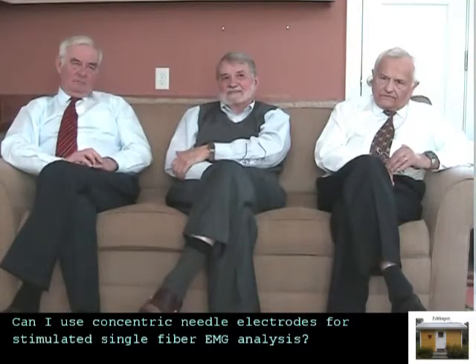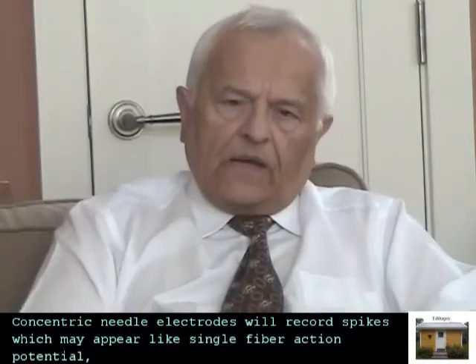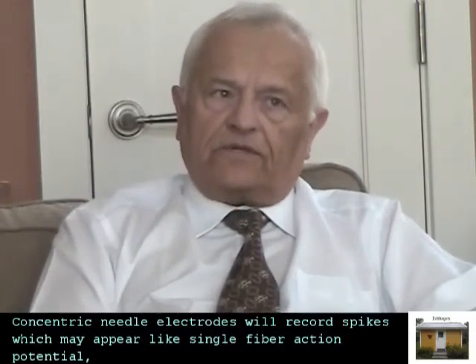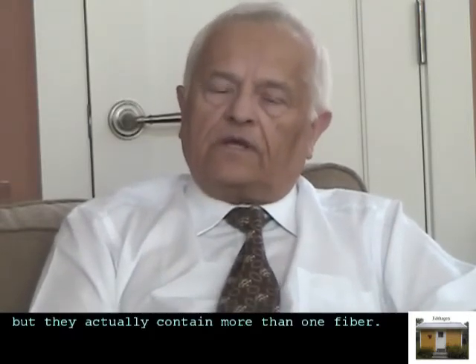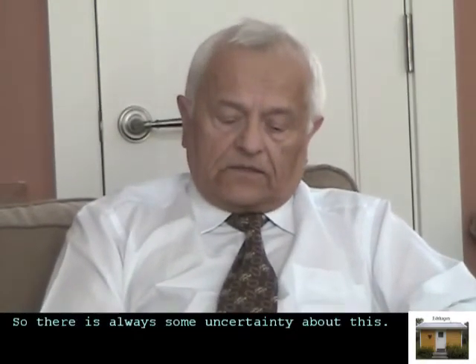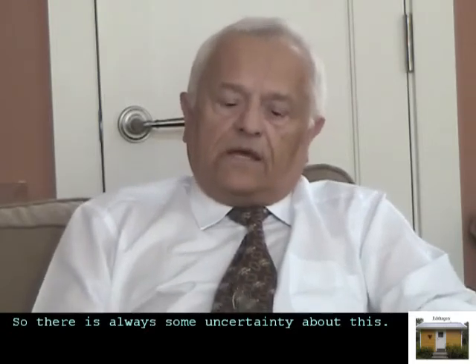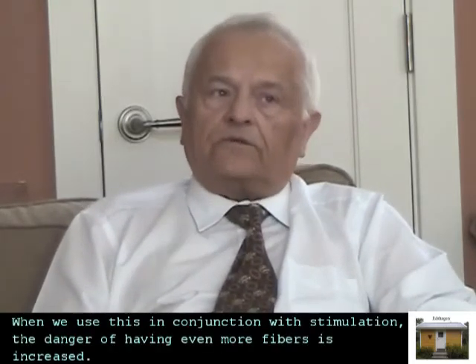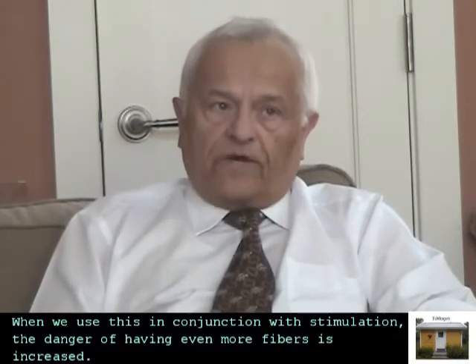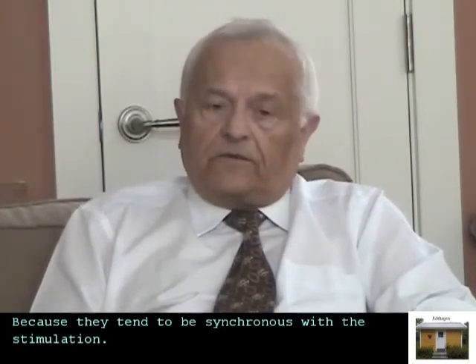Can I use concentric needle electrodes for stimulated single fiber EMG analysis? Well, concentric needle electrodes will record spikes which may appear like single fiber action potentials, but they actually contain more than one fiber. There is always some uncertainty about this. And when we use this in conjunction with stimulation, the danger of having even more fibers is increased, because they tend to be synchronous with the stimulation.